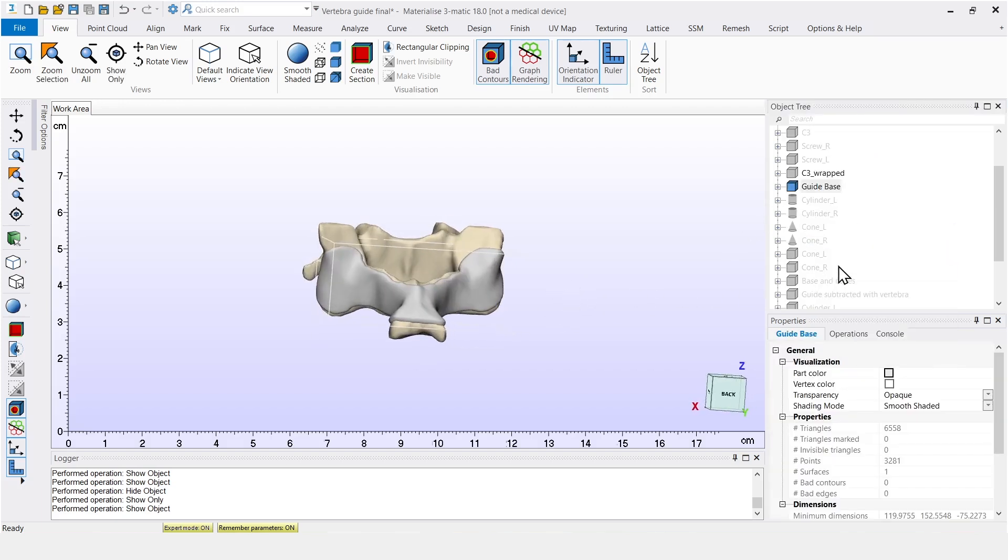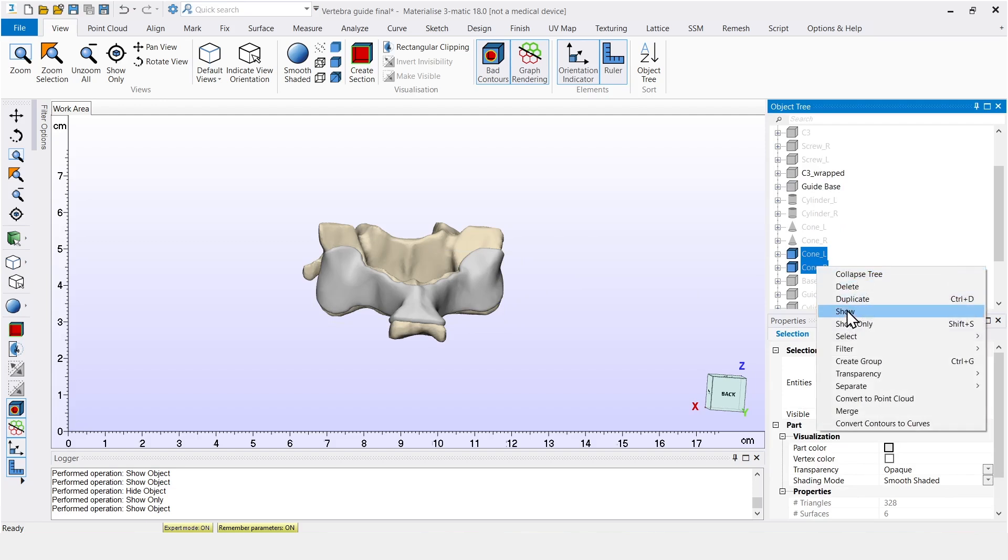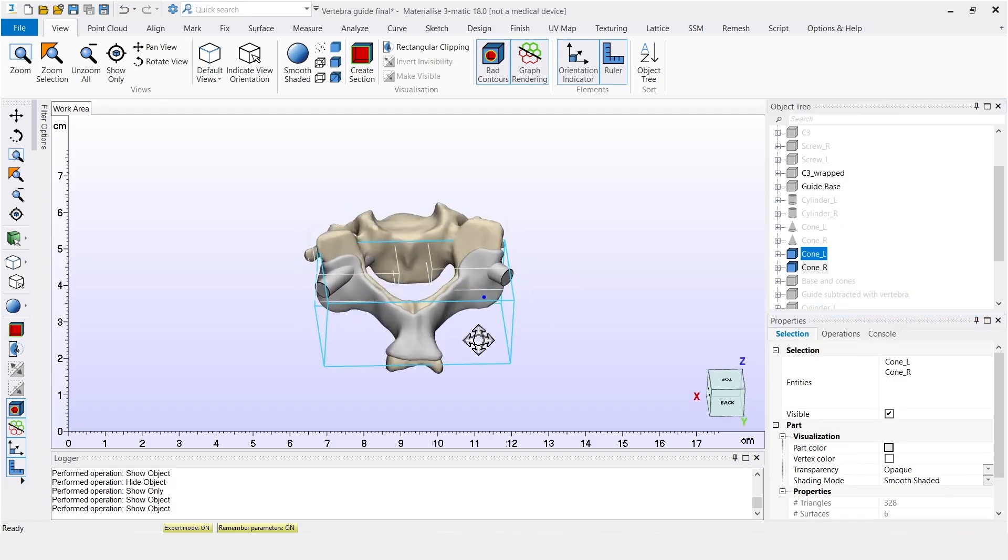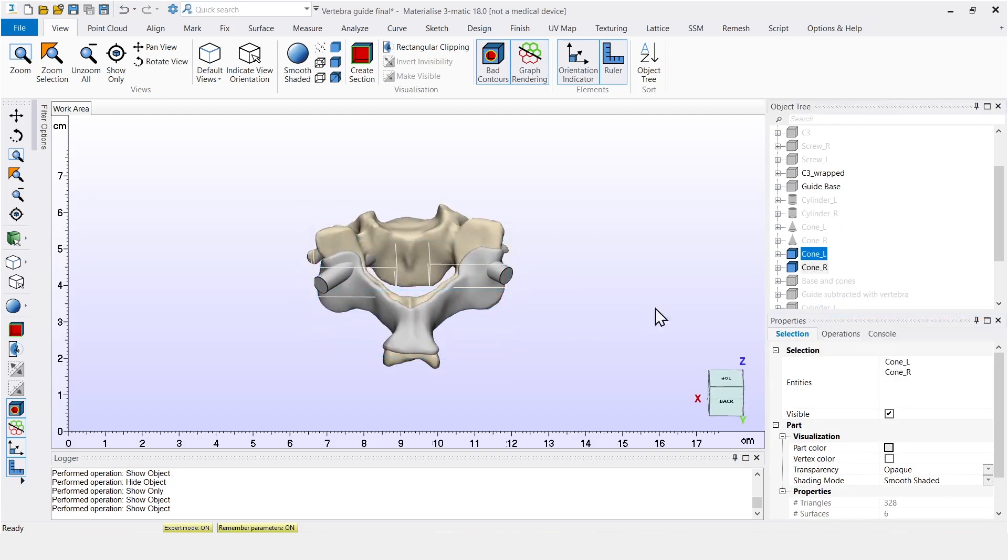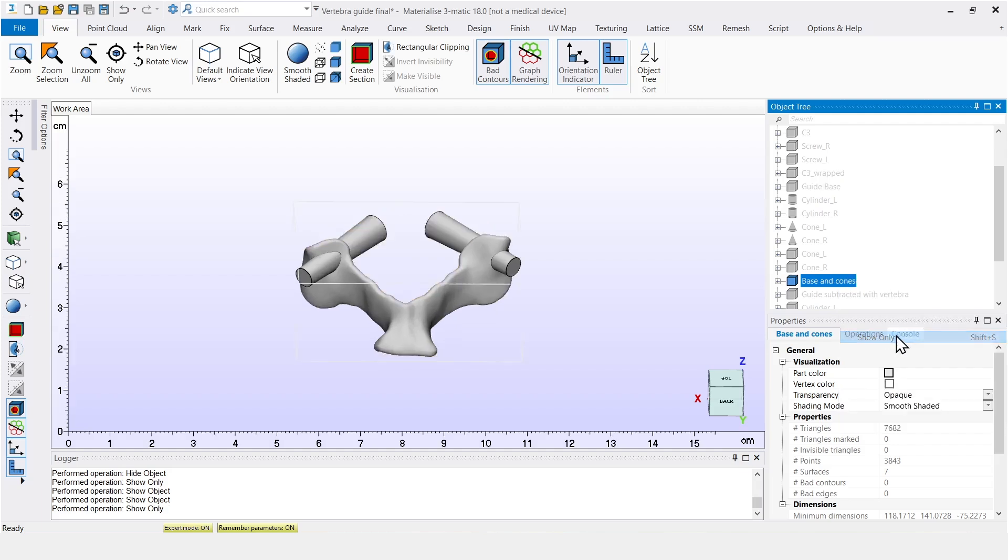Next, we design two cones around the position of the screws here. And these cones are then added to the existing base with a simple boolean operation.